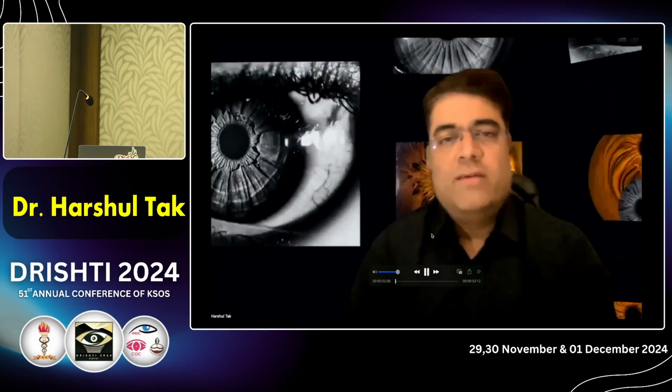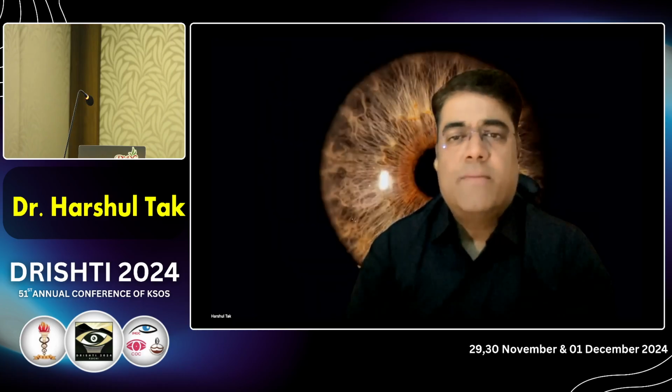Good afternoon, everyone. At the outset, I'd like to thank Dr. Vanashri Nayak for giving this opportunity to be a part of our instruction course. So today I'll be talking about how to do safe phacoemulsification in brown, black, and white cataracts.